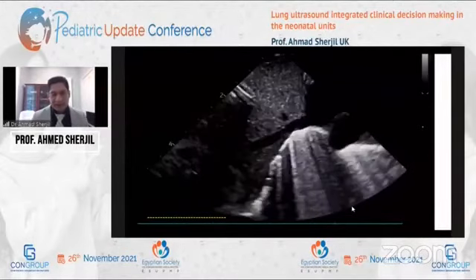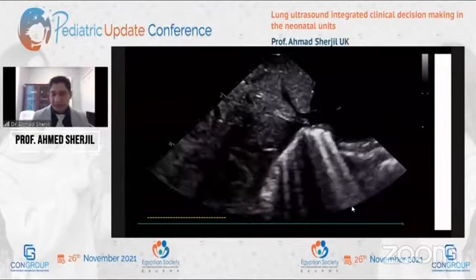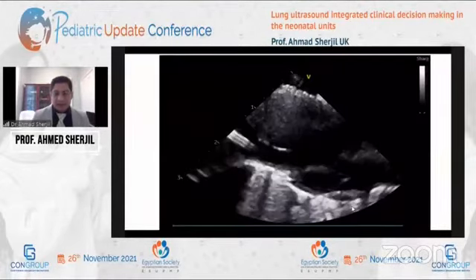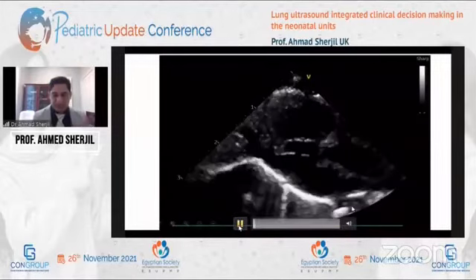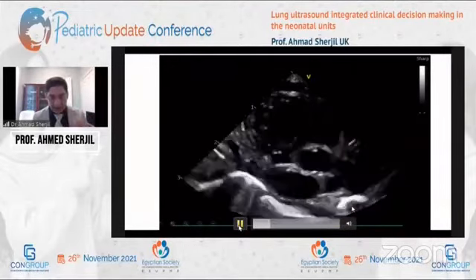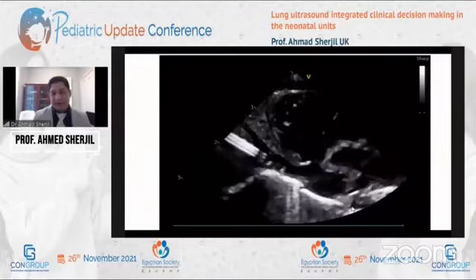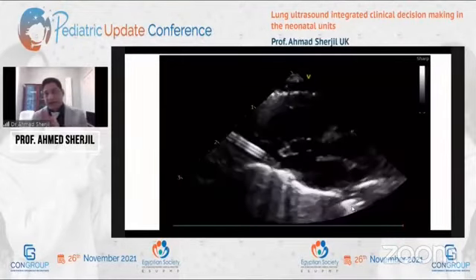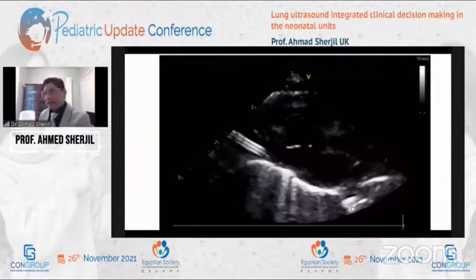The tip here, you can see here, is a little bit beyond being acceptable. So we moved it live, real time under the scanner, and then the tip was acceptable to me. The line was secured. Handover happened in time. Night team was able to go home.